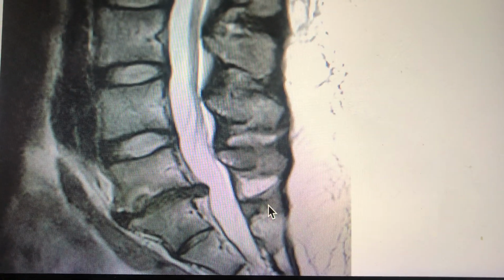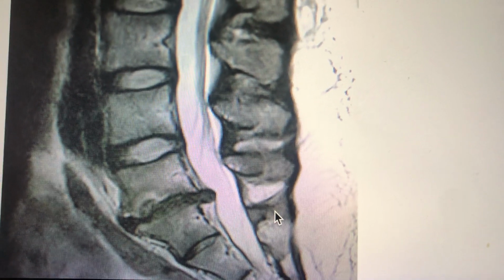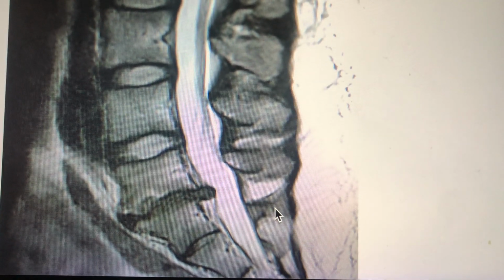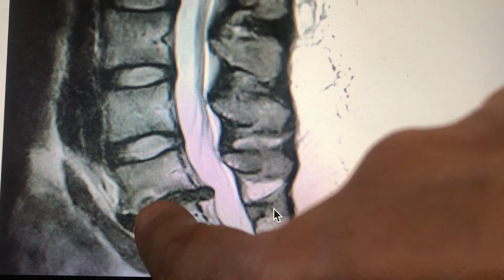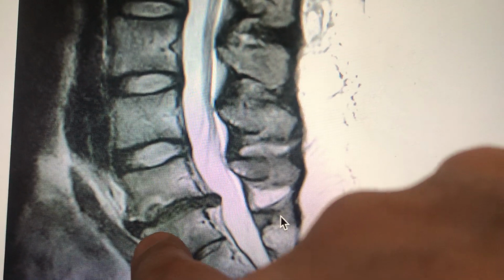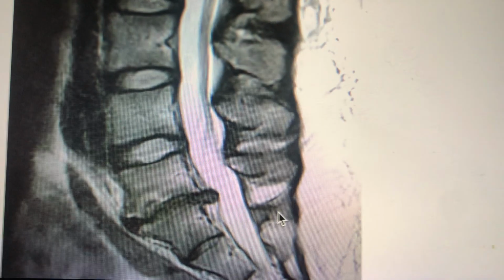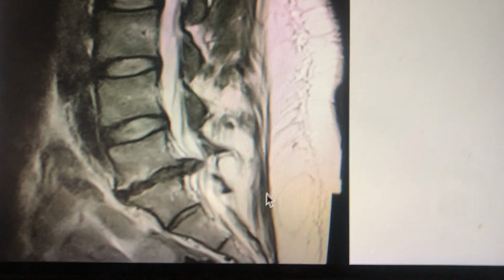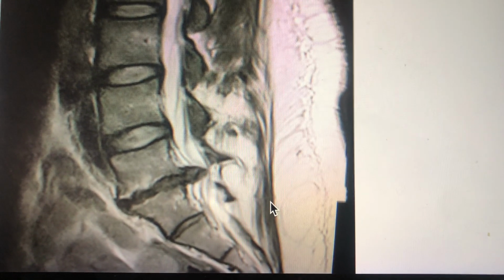I'm going to go to the next slide. Again, it's a little different slice, but you still see significant sticking out of the disc right there. Again, this is a better view to see the bone edema there in the L5 vertebra. You see it to a lesser extent down here in the S1 segment. Go to the next one. Same thing, sticking out a lot. On a scale of 0 to 10, well, I'll show you what I mean in just a moment.